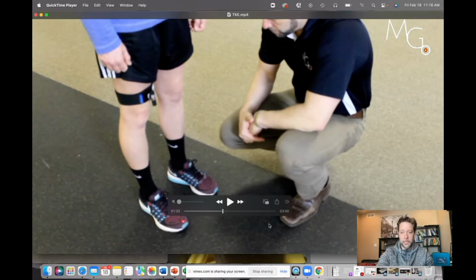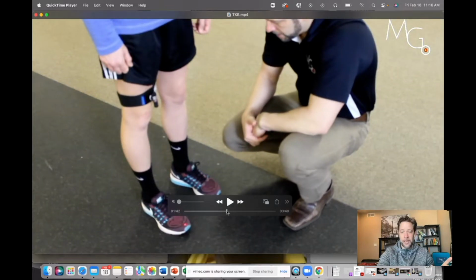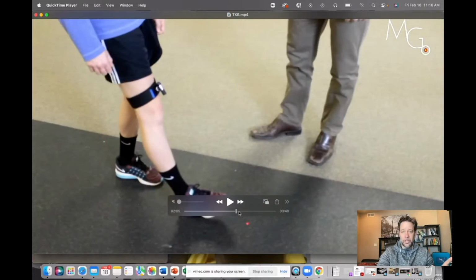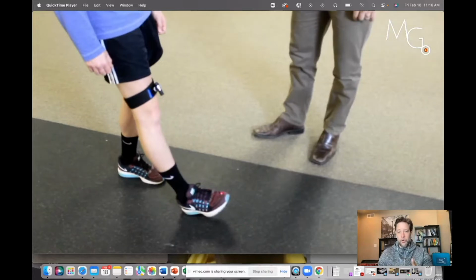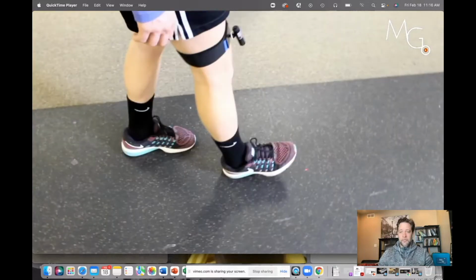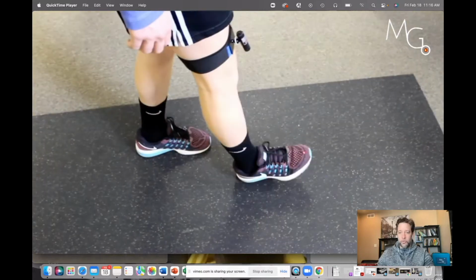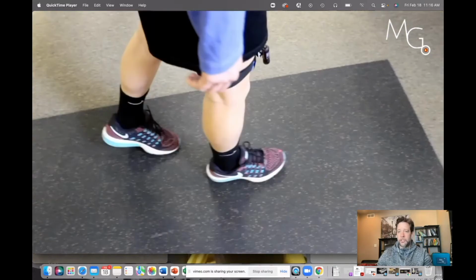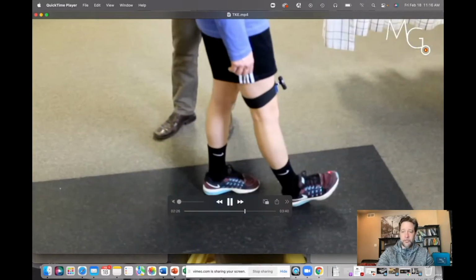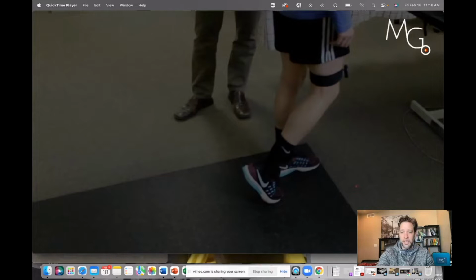All right, so that's going to be great. Once they have established that they can move actively back into extension numerous times like that, okay, then you might be able to help them get feedback for gaining that terminal extension during walking. Okay, so she's going to work on heel strike and terminal extension and maintaining that laser on the shoe as she acquires weight bearing. With an inefficient quad, that laser is going to want to push right off the foot or the shoe as soon as they go into full weight bearing there. All right. So that can be a nice application for transition to gait to make sure they understand how to hold their quad from making that knee become unstable.